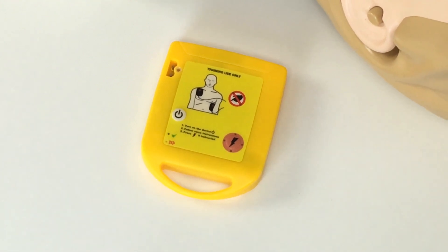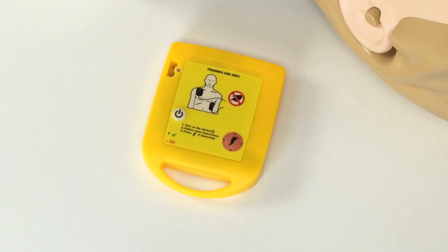After inserting the batteries, you turn the unit on by pressing the power button and start to follow the voice and visual prompts.